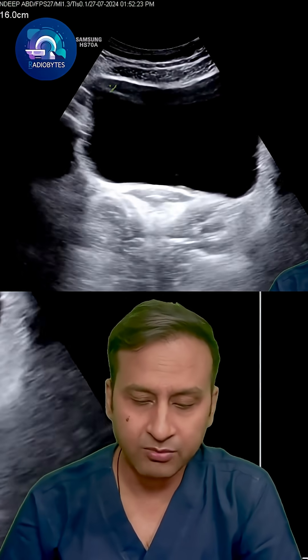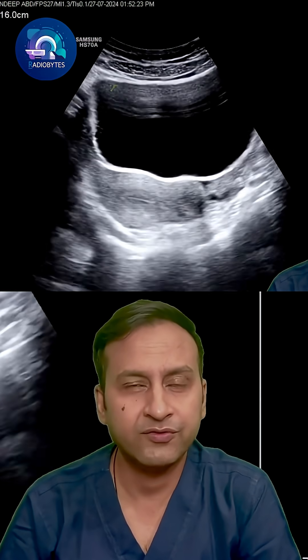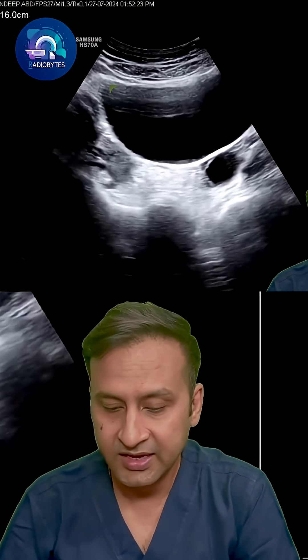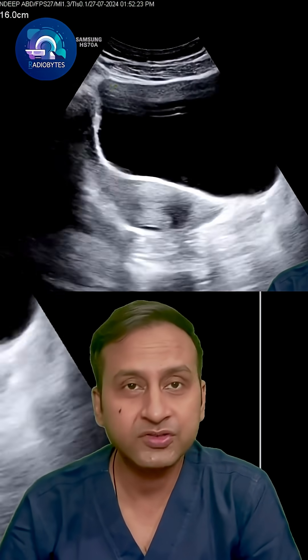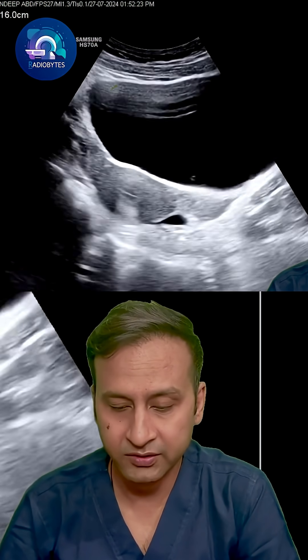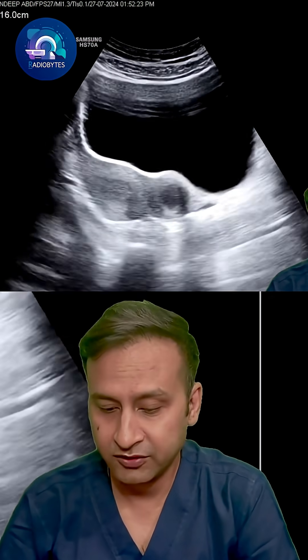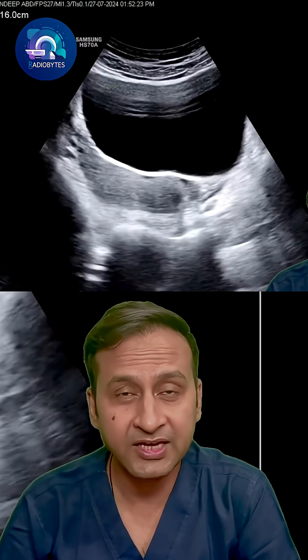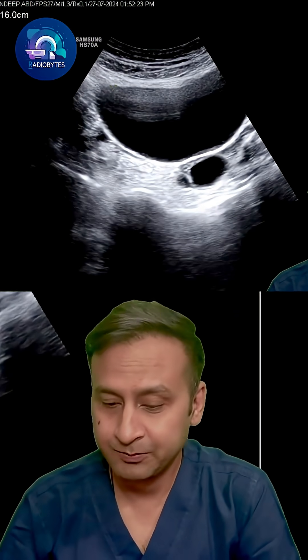I want you to have a look at this transabdominal scan and make your own observations. What do you see here? We can see the uterus, we can see the ovaries, and apart from the uterus and ovaries there's something wrong — there's something additional which is seen in the left side of the uterus. What is this particular pathology and why is it causing pain in this patient?